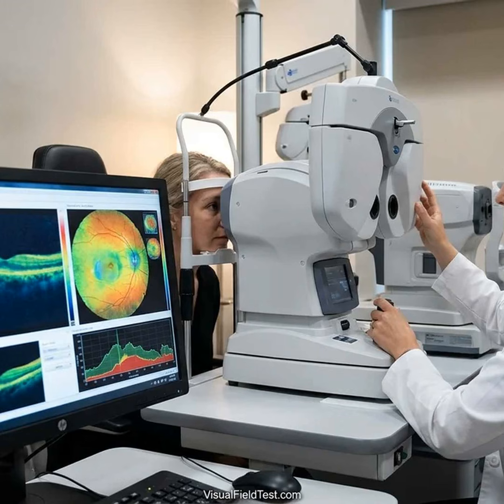Correlation with visual field. In moderate glaucoma, OCT changes and field changes may occur together or one after the other. A useful pattern is sometimes called the broken stick model. Early on, a small drop in RNFL may cause little or no field change, but once the nerve is much thinner, small further losses lead to bigger field defects. This means a structural OCT change now could mean a functional field change soon. If OCT shows definite new thinning in moderate glaucoma, doctors usually do not wait for the field to catch up. They will consider escalating treatment, for example, tighter pressure control, because it suggests progression.